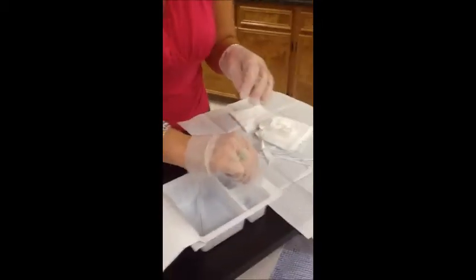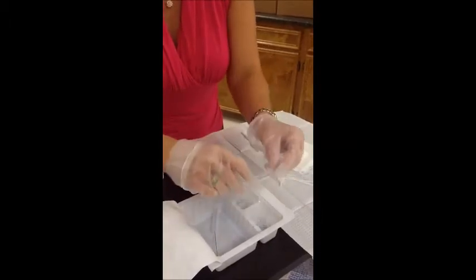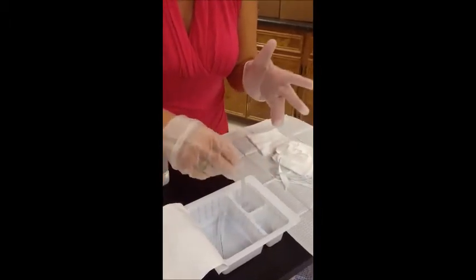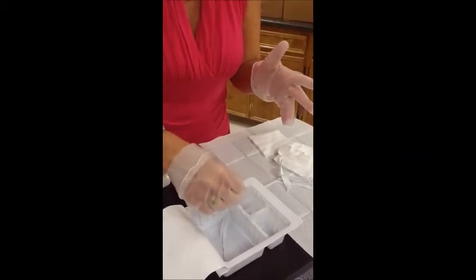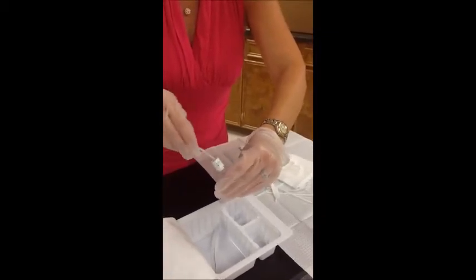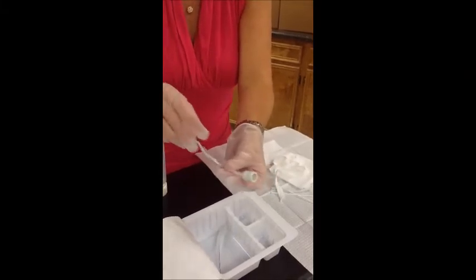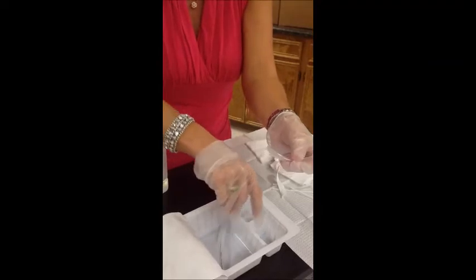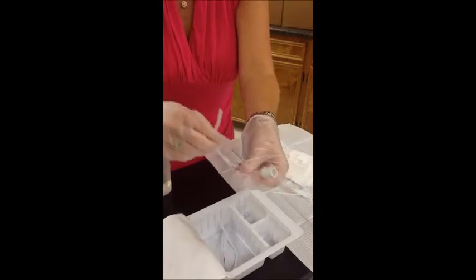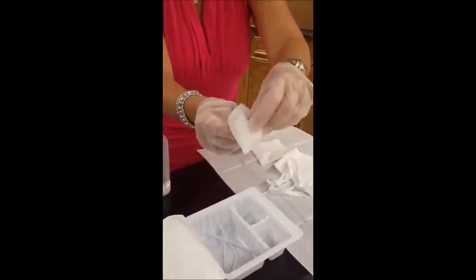I'm going to come to my saline. I'm going to dip it in there. I'm going to dip it back in there. Just kind of rinsing the peroxide off of there. Tap it out. Now I'm going to take my pipe cleaners. Drying, excuse me, I didn't mean to say clean. Drying. Could take another one. And dry. And dry. Then I want to take one of my 4x4s. And I just want to make sure I get things good and dry.